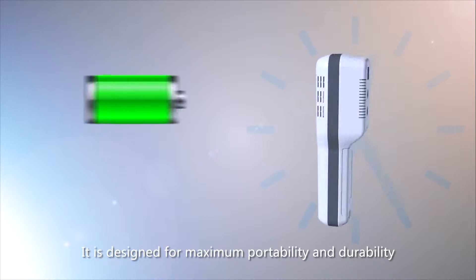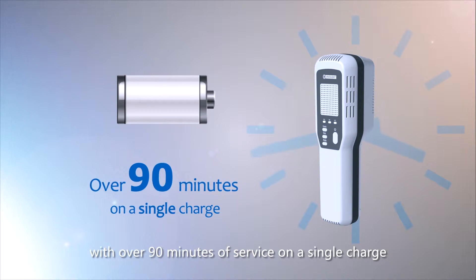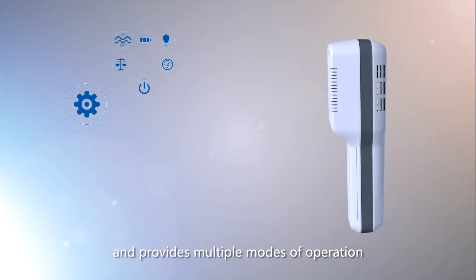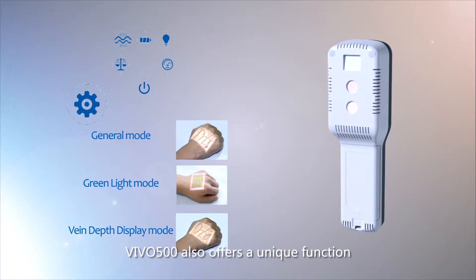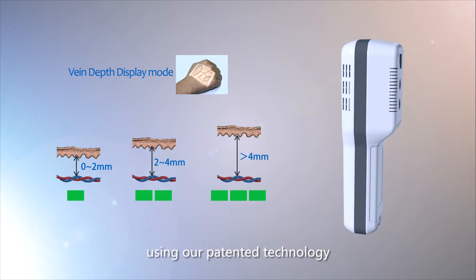It is designed for maximum portability and durability, with over 90 minutes of service on a single charge. It accurately displays the vascular image within 4 seconds of activation and provides multiple modes of operation. VIVO 500 also offers a unique function that estimates the depth of the target vein using patented technology.